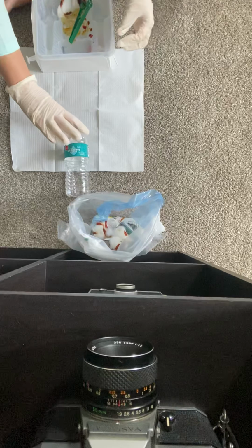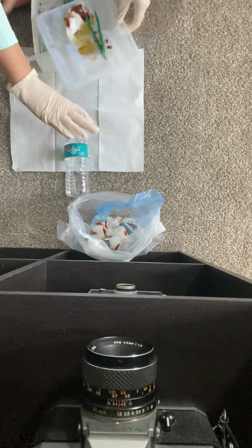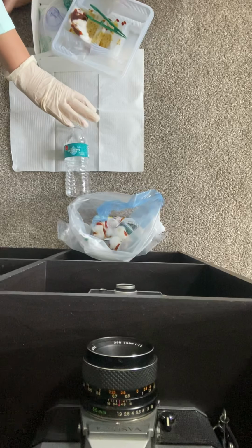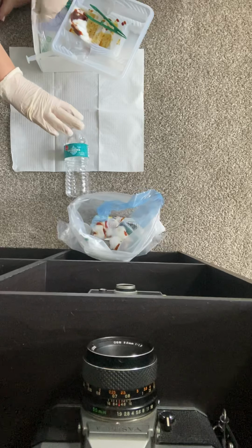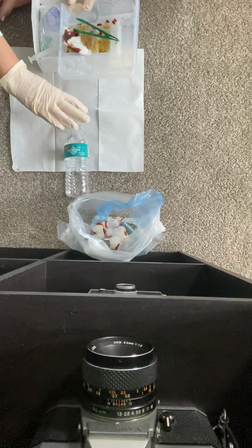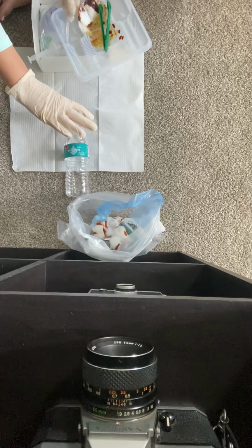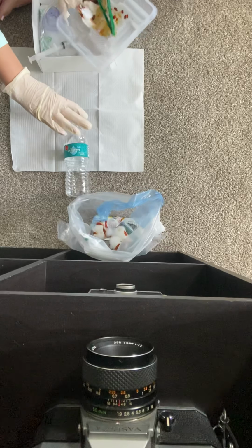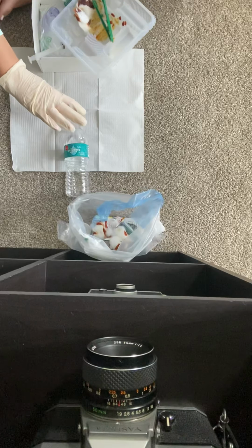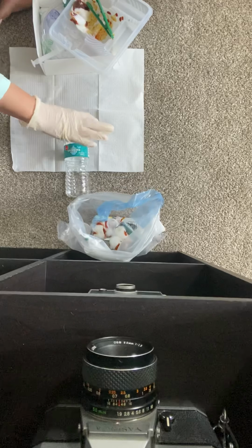Next, I still have my hand here. I would keep my hand here and have the labia majora open. Then I'm going to grab my catheter tip and put my lube on. I honestly should have done the lube before, but that's okay. Okay, so I lubed up my catheter tip and I still have the labia open.